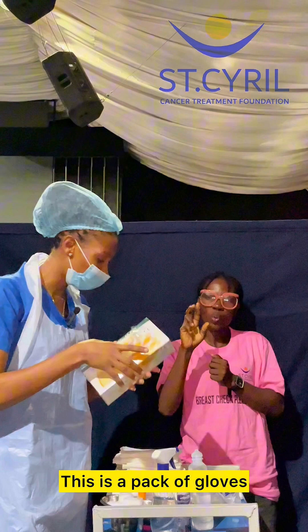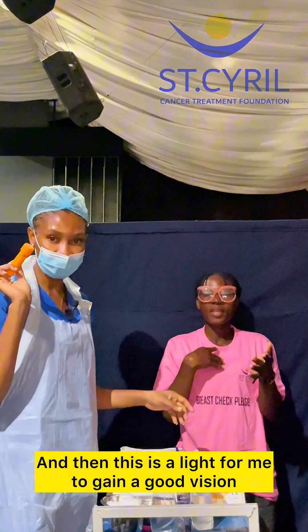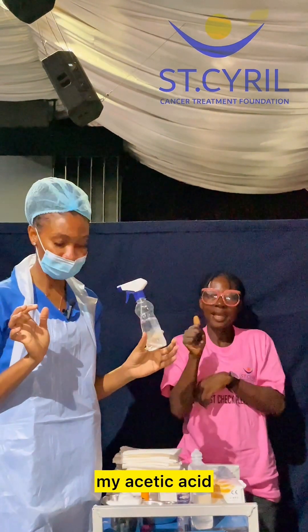This is a pack of gloves, and then this is a light for me to gain a good vision. And then, of course, last but not least, my acetic acid.